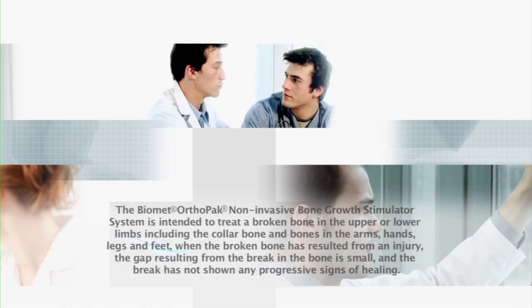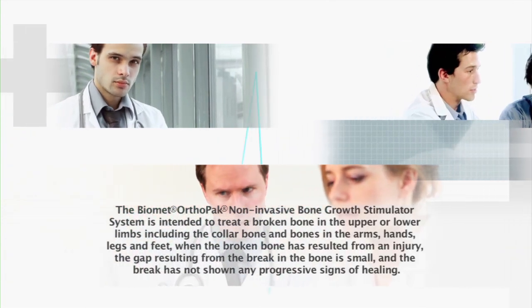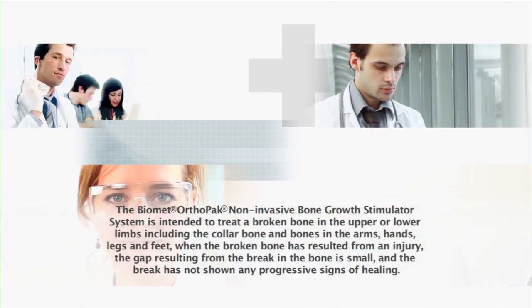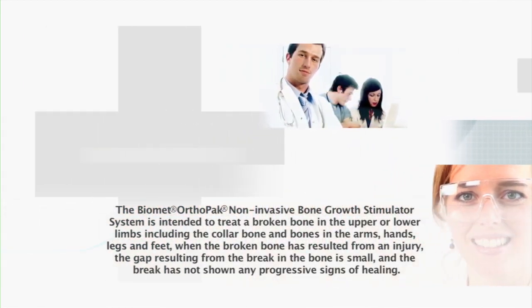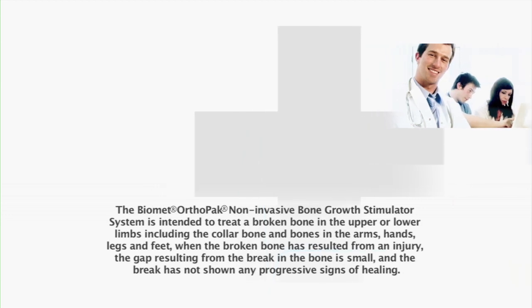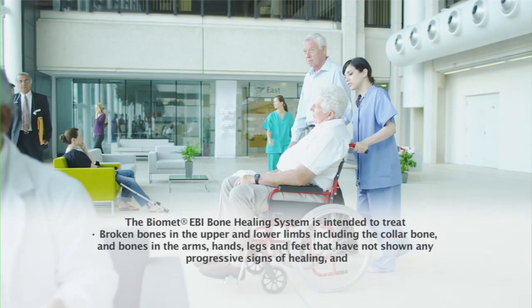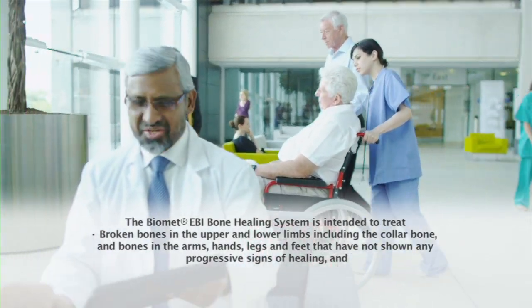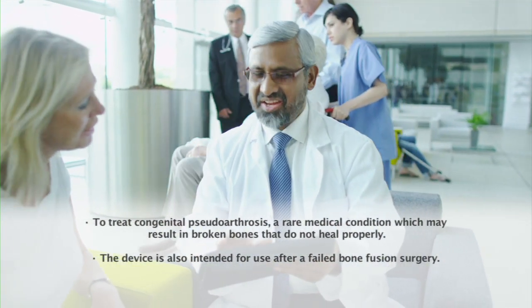None of these devices should be used if you have or may be in close contact with someone who has a pacemaker, cardiac defibrillator, or any type of implanted or externally worn electrical medical device, or if you are pregnant or may become pregnant, as the safety of these devices during pregnancy has not been established. To avoid the risk of electrical shock, do not use these devices while near water or while bathing, showering or swimming. Use of Biomet's bone stimulation devices may impact bone growth if used to treat adolescents.